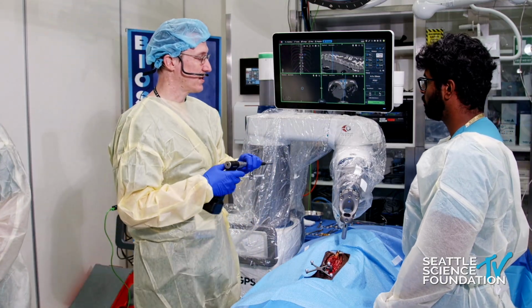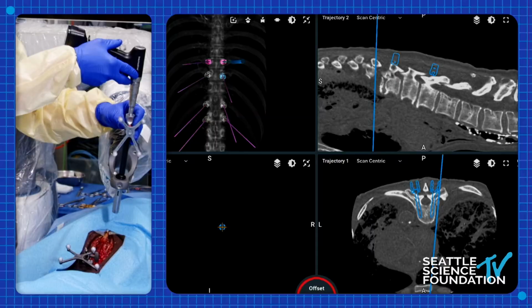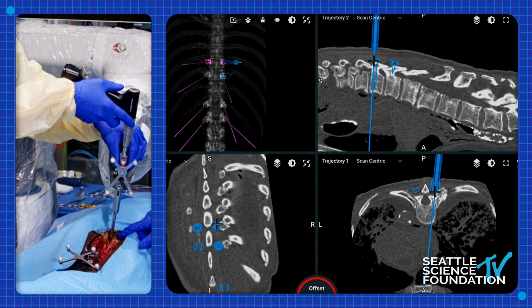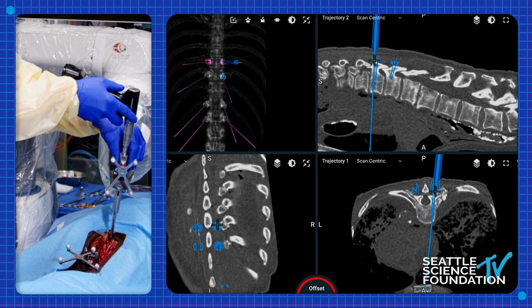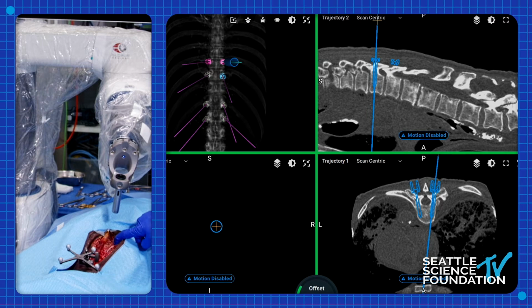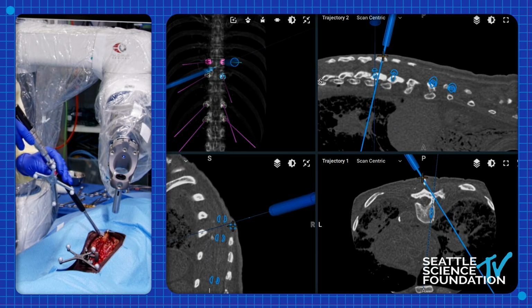And this is just simply to make a little divot for our side cutting router to go in. As emphasized before, we really don't want to force ourselves on anybody or anything. We want to go nice and soft. We want to make sure that we're lined up. So I'm going to resend that, make sure that we're still in the green. If we need to do anatomy checks, we can do that with our instrument.